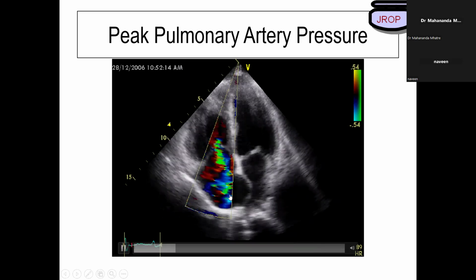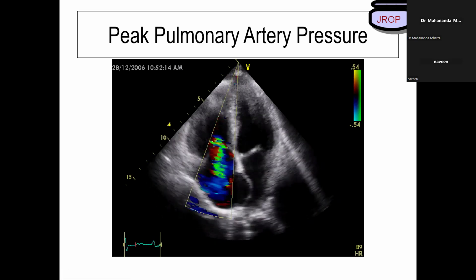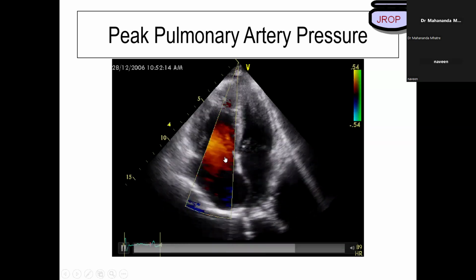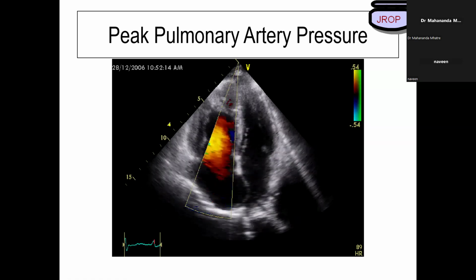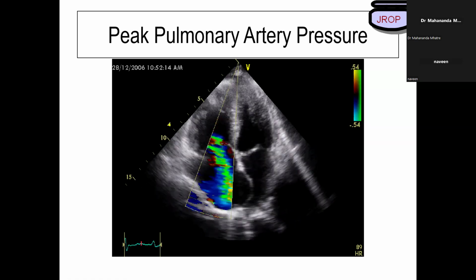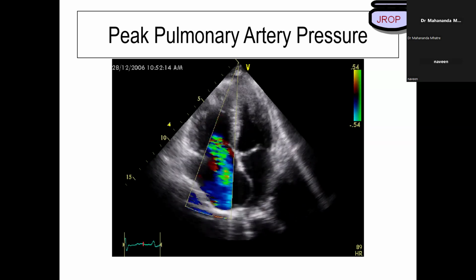I'm not aligning it. That's why I asked you this question. That is the reason why I asked you this question. And once you do it, believe my words, you will get excellent Doppler readings. I'll try. Definitely. Okay.